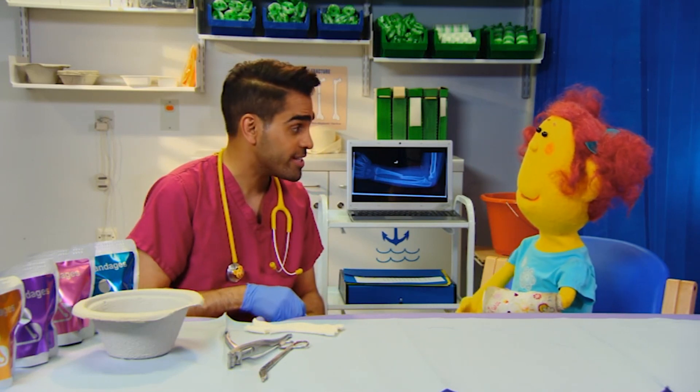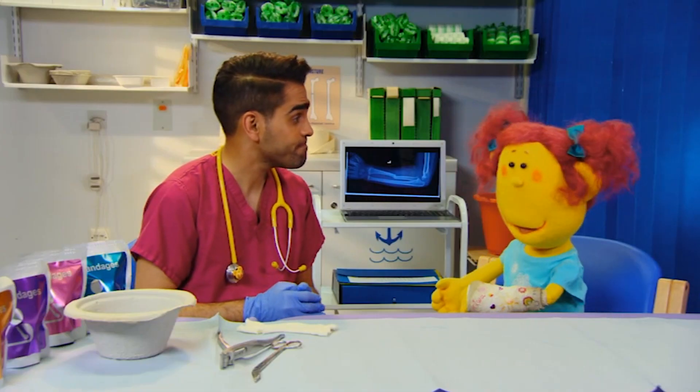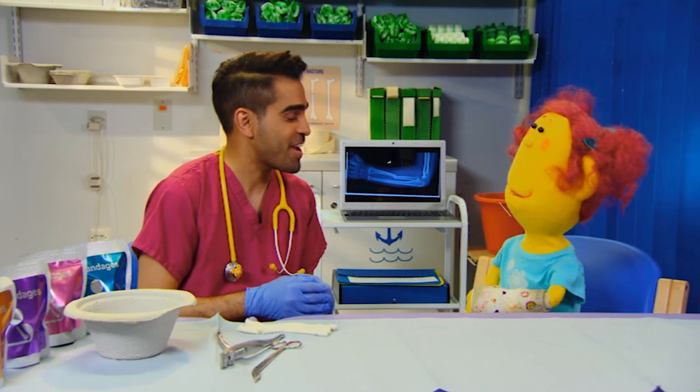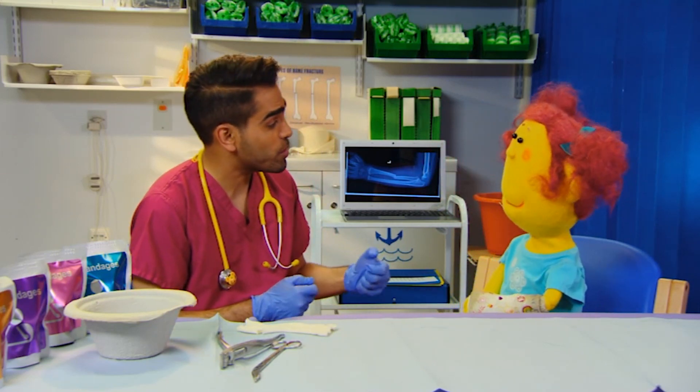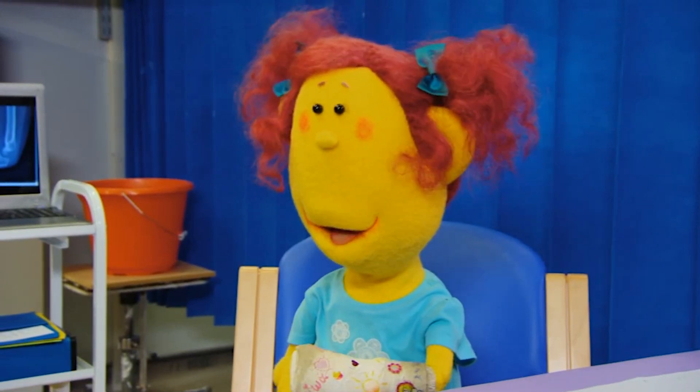Your new cast will be lighter and you'll be able to wipe it clean. Oh, good. So first, we need to carefully remove your old cast. How? It's really stuck on. Don't worry. I've got a special tool that will cut it off very quickly and easily. Will it hurt? No, it won't hurt, Petal. The tool I'm going to use isn't sharp like a saw or scissors. It cuts the plaster with lots of tiny vibrations. What does that mean? That means it's very shaky.